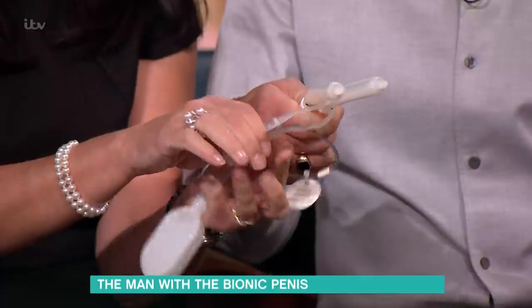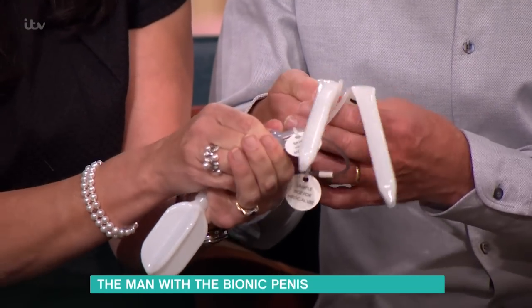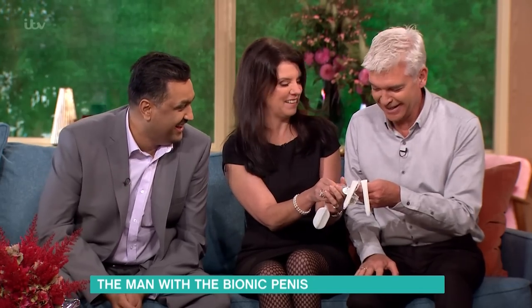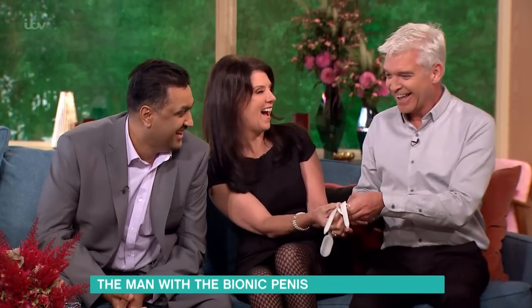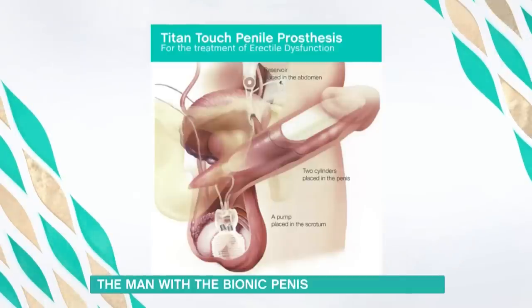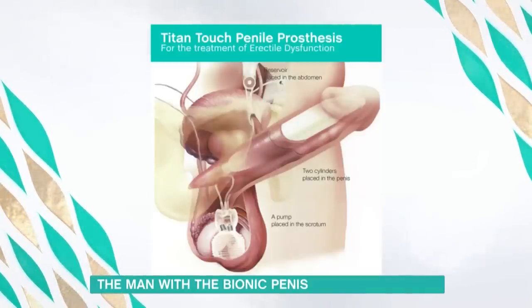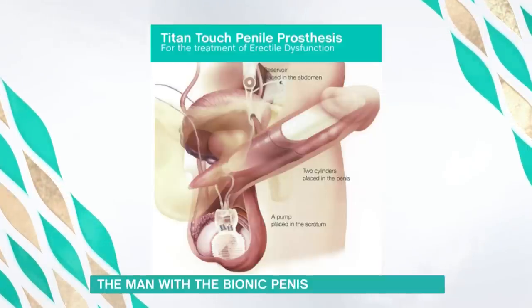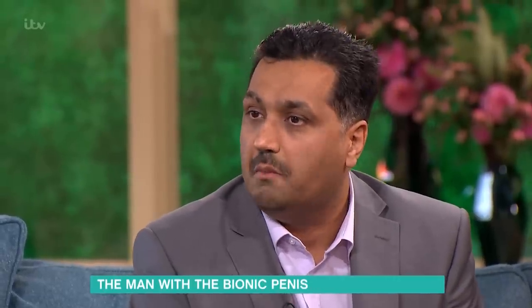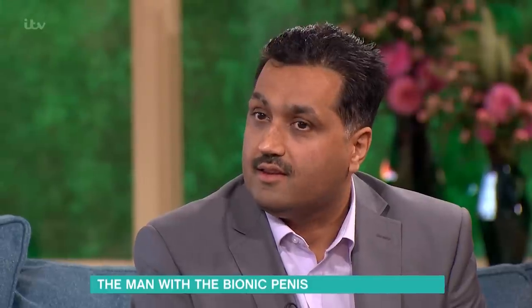They're starting to go down now, just because it's new. That button Dawn is pressing is actually in your scrotum, just slightly above the one that's obviously there. There's a deflate and an inflate button — inflate first and then deflate when you finish. You have to press it through the skin. It is a bit sore just now because it's fairly new, but over time it'll calm down.